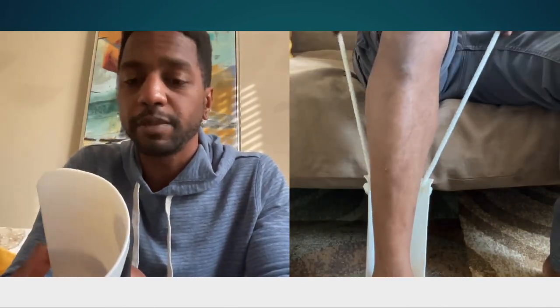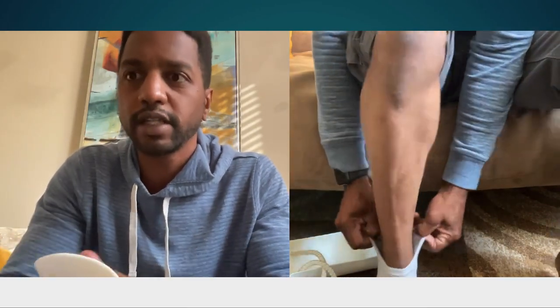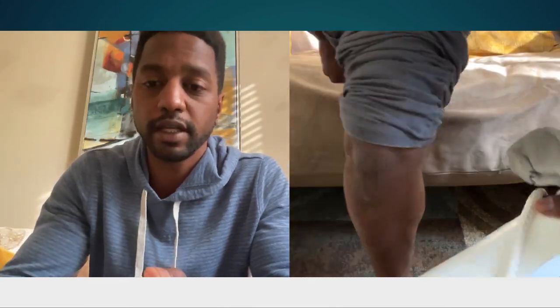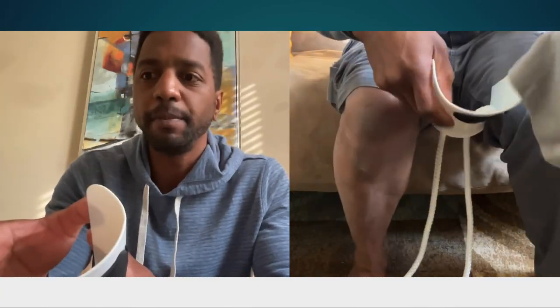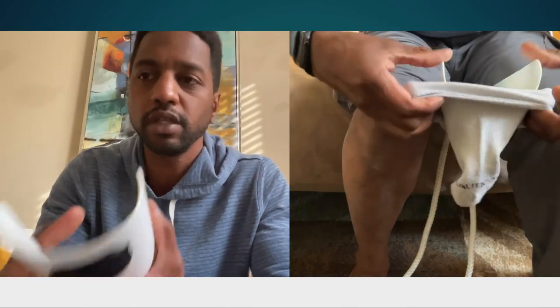You can use this with any type of sock for the most part — slipper socks, standard socks. Now with compression socks you want to be mindful of the amount of compression, as if the compression sock has too much compression it's going to bend the device too much, so you can get away with lower grade compression using this device.